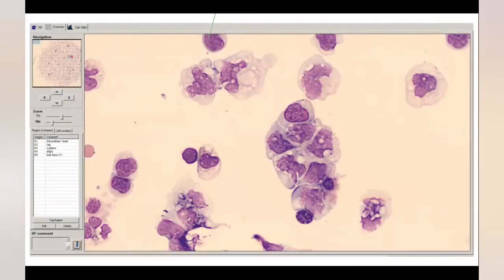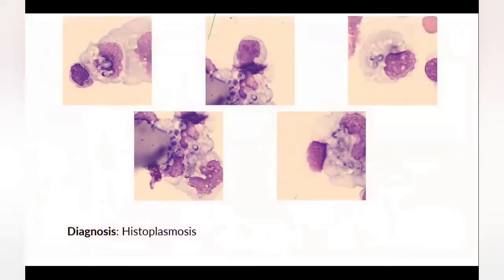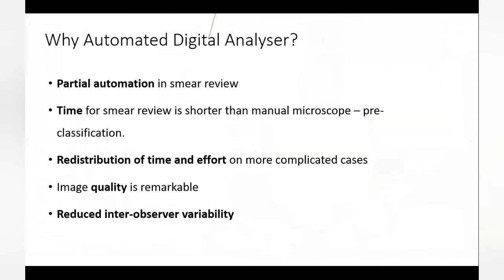And these were the types of cells that were found. And it was a diagnosis of histoplasmosis. So in short, I think I tried to make a very similar point throughout my presentation. And what was that? A few points rather.